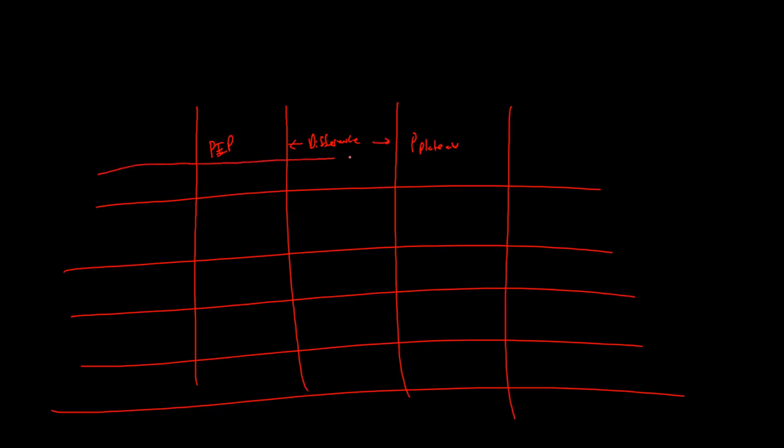Okay, and let's put another one here. So here's sample number 1, sample 2, and so forth. If we have a patient, this is our baseline. They have a plateau pressure of 20, and they have a peak inspiratory pressure of 23. What's the difference between those two numbers? 3. Okay, 3.